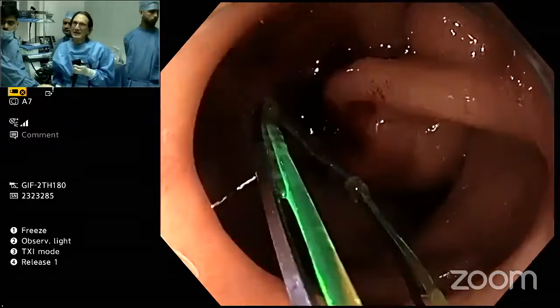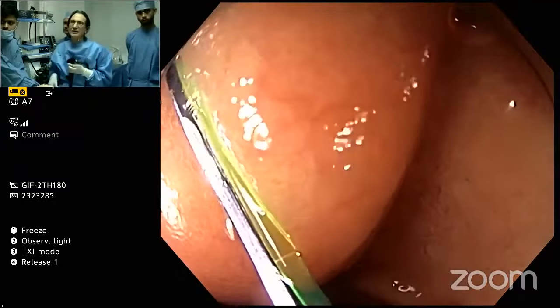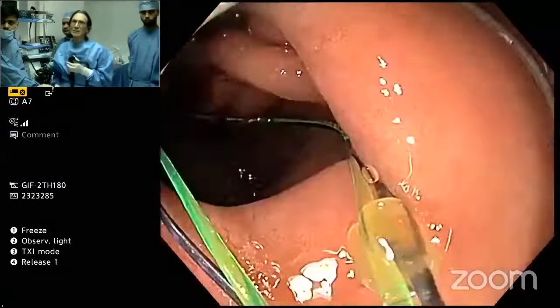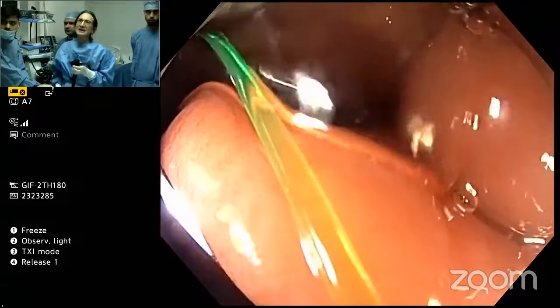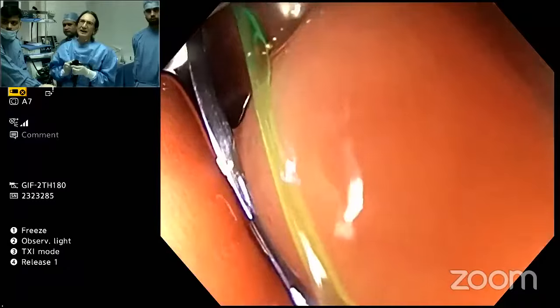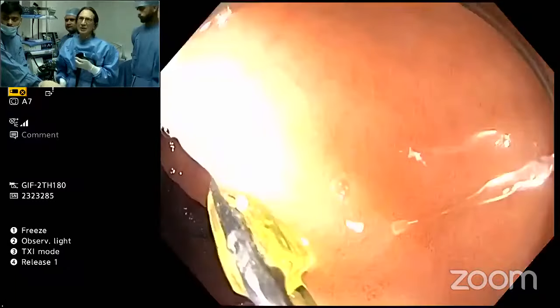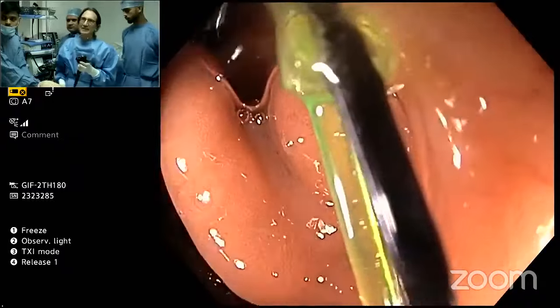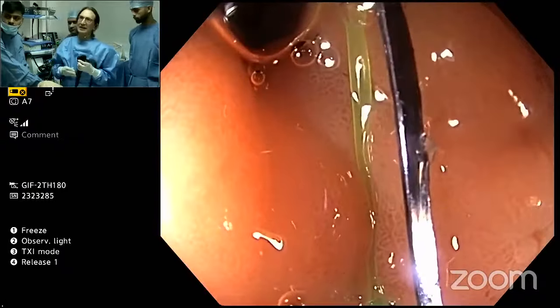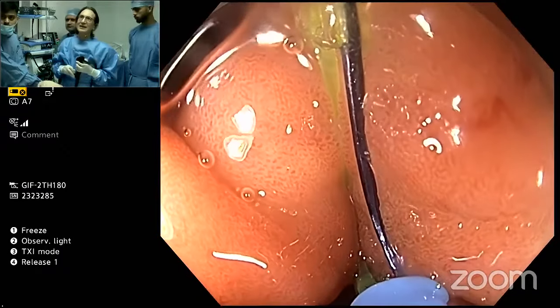And what I'm going to need to do is hook it enough so that I can get it around like this. Oh, I need you holding this, please. And I need to make sure I can swivel this all the way around it like this. And now I'm going to pull back just a little bit. So this is where, at the pylorus, your scope wants to fly back constantly. But I think this is, see how I got a nice stiffness? I think I'm at the base. Okay, I think I'm good.